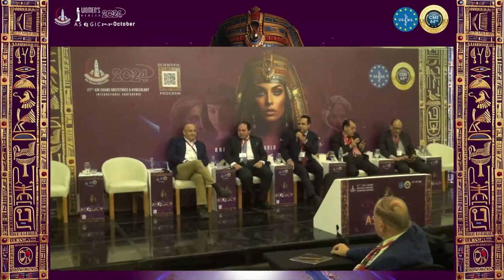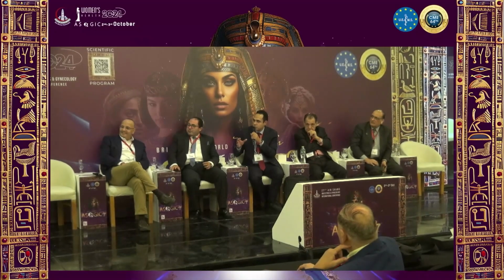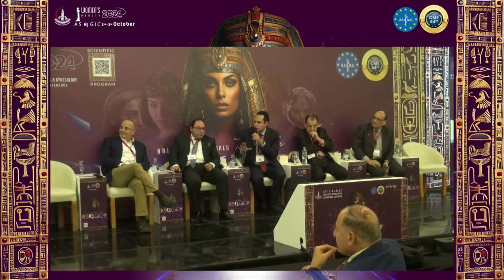Thank you for this excellent lecture. I have two little questions for you. The first, during patient selection, do you have a size limit of the myoma? I recognize you are talking about FIGO type 3 myomas, whatever the size, or is there a size limit? The second question is, after removing the myoma, do you need to have a second look hysteroscopy after some while, or you don't do this?